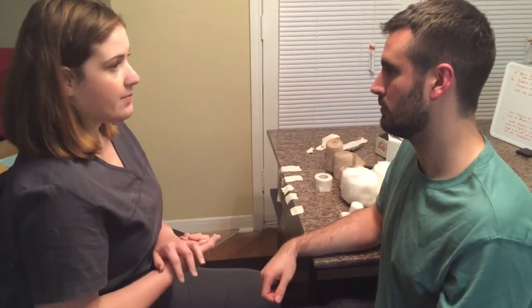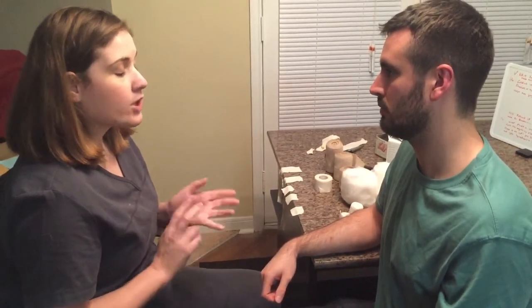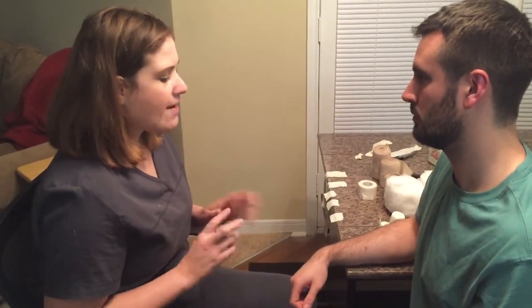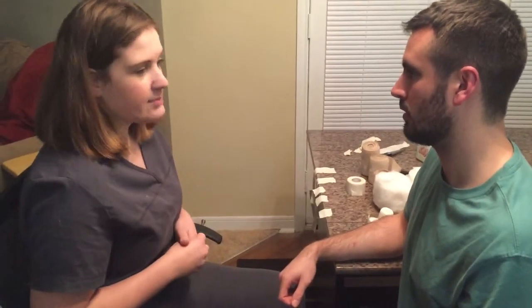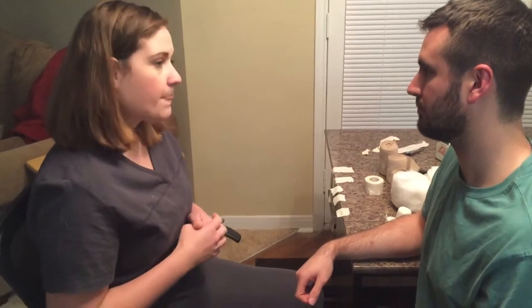All right. Before we get started on this, I want to make sure that you don't have any problems that you need to worry about. Do you have any sort of cardiac issues, deep vein thrombosis, recent fractures? You don't have any infections going on, anything like that? I've checked your chart already and you're cleared for everything, but I'd just like to double check with the patient.